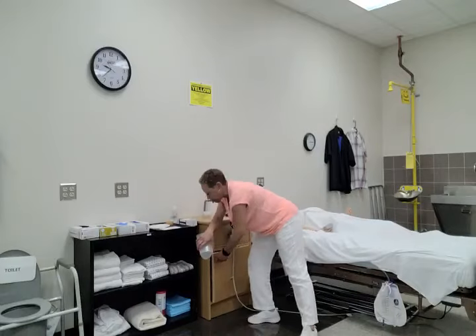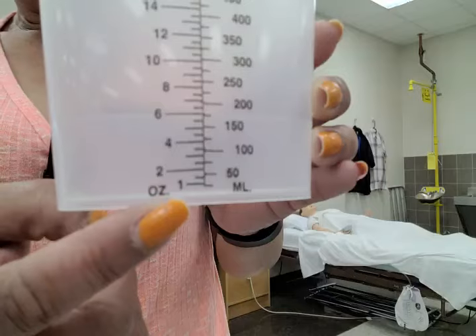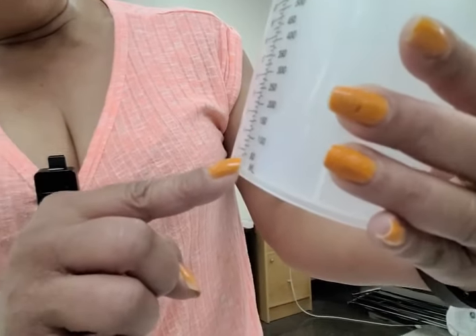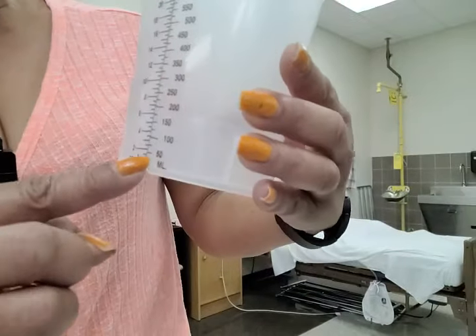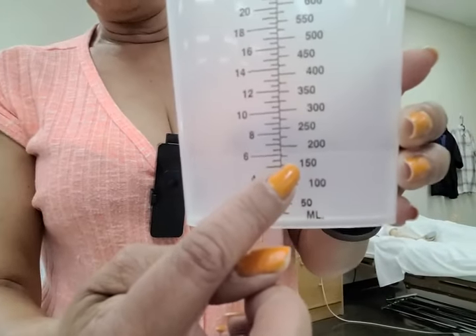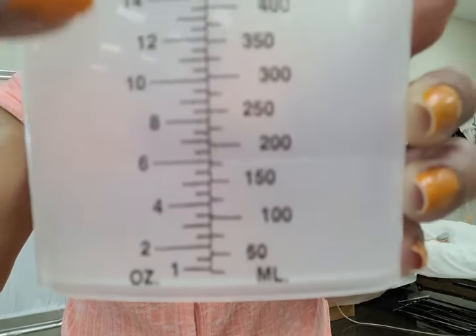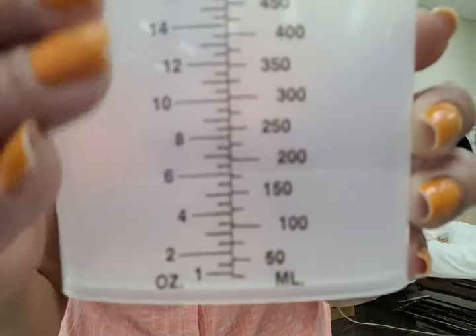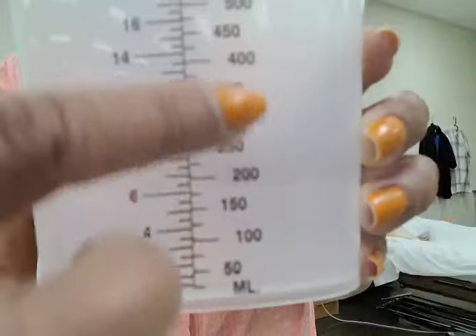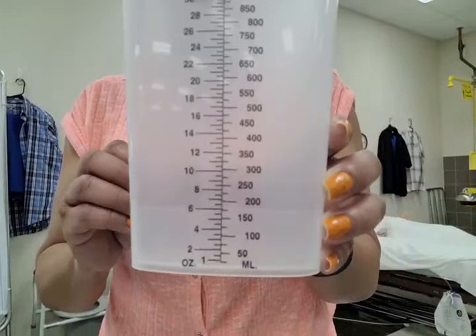What I want to show you on this measuring container is that it is in increments of 25. So you have zero, then the smaller mark is 25, then you have 50, 75, 100, 125, 150, 175, 200, and so on. On the other side, the measurement is in ounces — so you don't want to measure on that side. Use the numbers on the left side, which are in milliliters. Your measurement needs to be in increments of 25 milliliters.